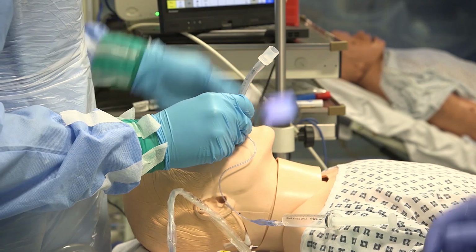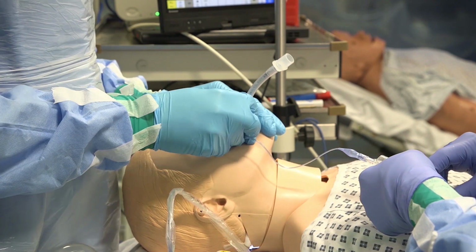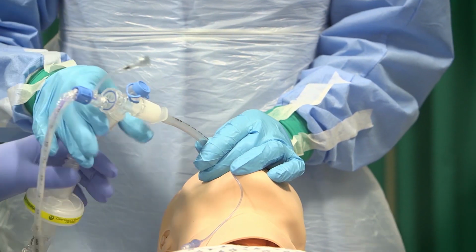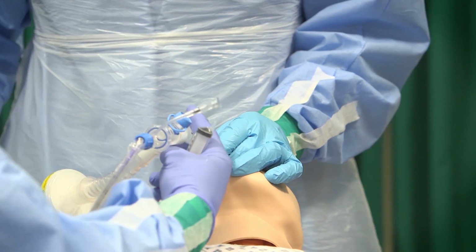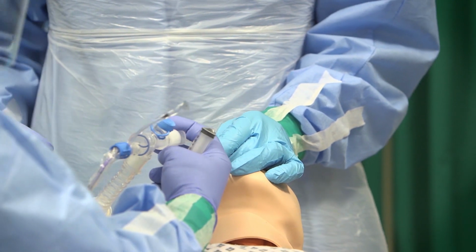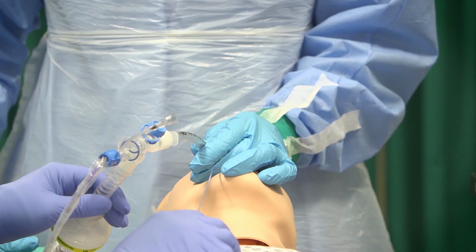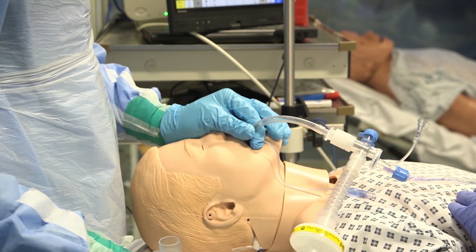Thank you. And cuff inflated. Okay. Confirmed clinically, we have bilateral chest movement and we have end-tidal CO2.